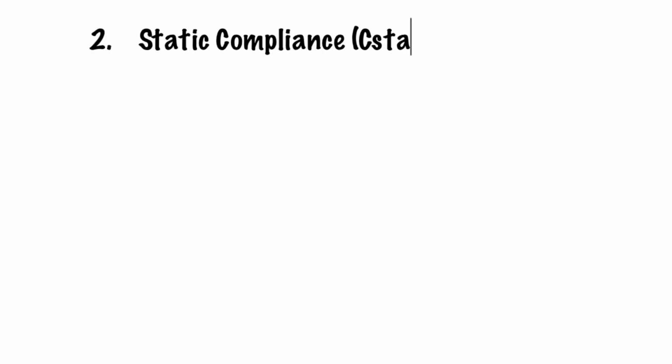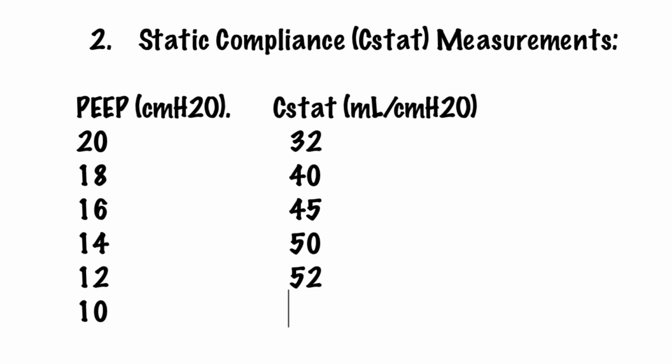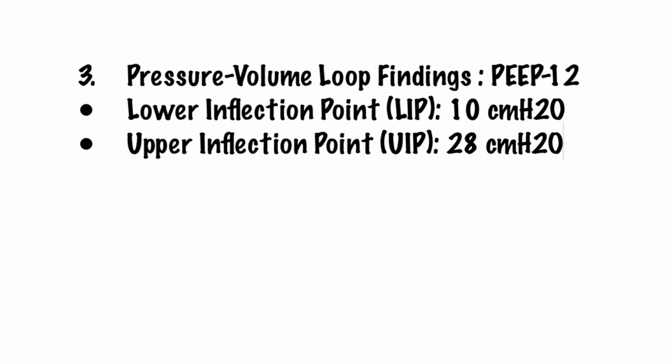Two, static compliance, C-STAT, measurements. Three, pressure volume loop findings. PEEP 12, lower inflection point, LIP, 10 cm H2O, upper inflection point, UIP, 28 cm H2O.